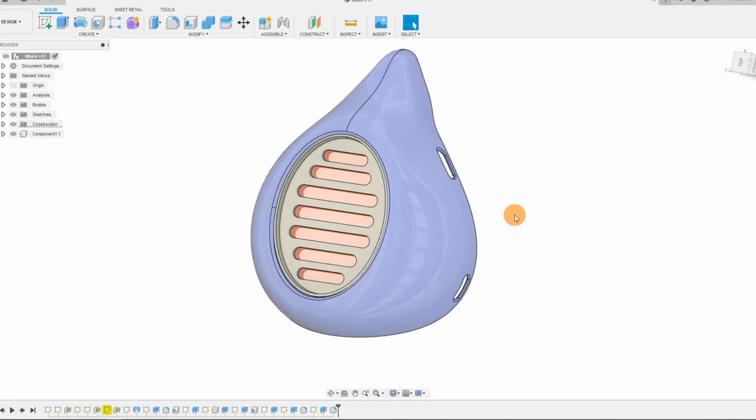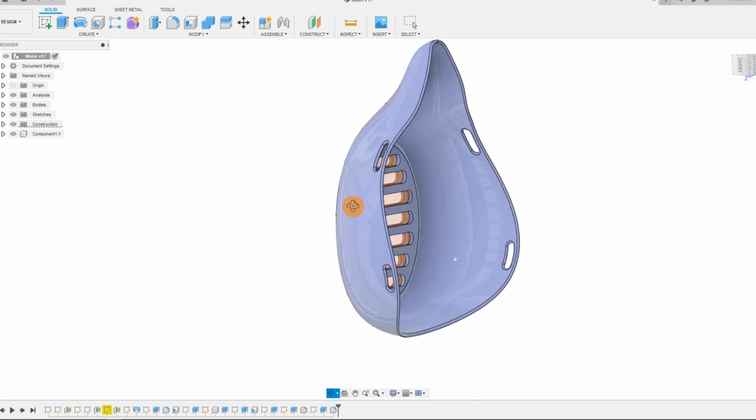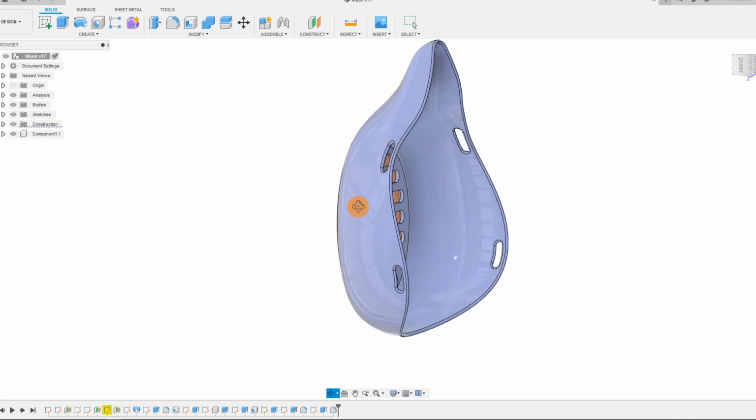In this tutorial, we're going to create some changes to our original mask design. And what we're going to do is add a foam gasket to the inside here for some more airproofing.